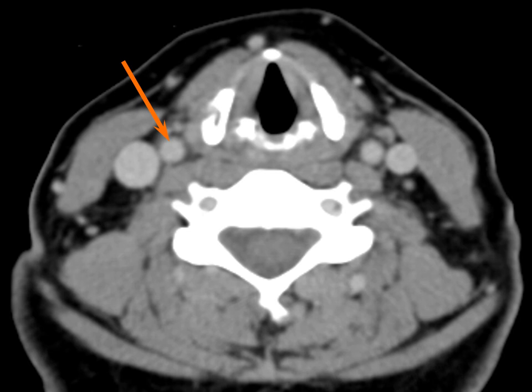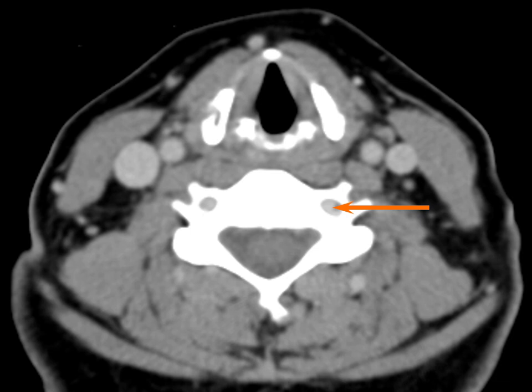Now let's talk about the vessels. The more medial and usually smaller of the vessels is the carotid artery — at this level, still the common carotid artery. Lateral to that is the internal jugular vein, which is variable in size but usually a little bigger than the carotid. Here are the vertebral arteries in the foramen transversarium of the vertebral body. This oval is the location of the cervical spinal cord — it's very hard on CT to distinguish between the cord and surrounding CSF, but MRI and myelography are ideal for that.